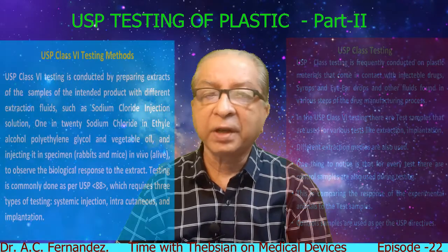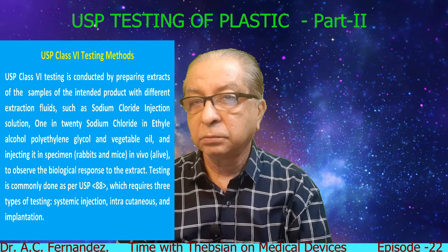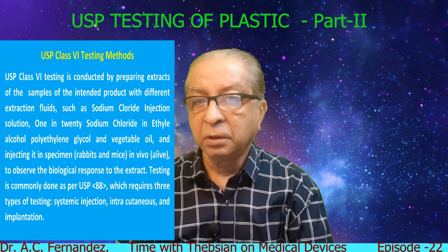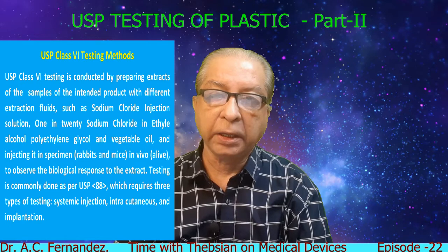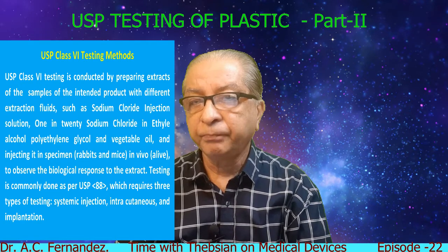So many different types of plastics are used for making containers. There are cheap plastics, there are very costly plastics which are very safe.